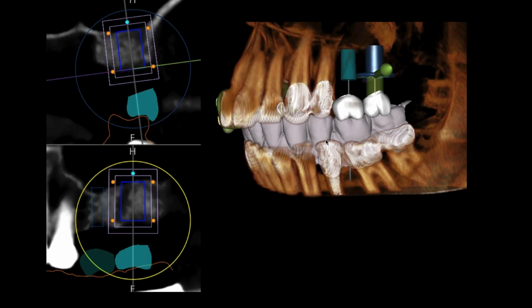Now, just for benefit to show you, I took the upper one out, and you can see the virtual teeth in position on the lower teeth. So I know those are correctly positioned. And then you see on the left side, the rectangles are showing me the plan. The first line outside the blue, this line over here, when my cursor is there, that's a millimeter, that's 2 millimeters. So you can see the distance between the implants is going to be 3. So we're in good shape.